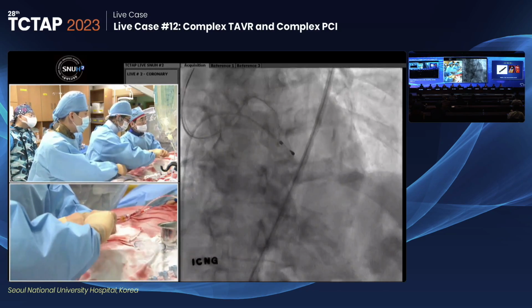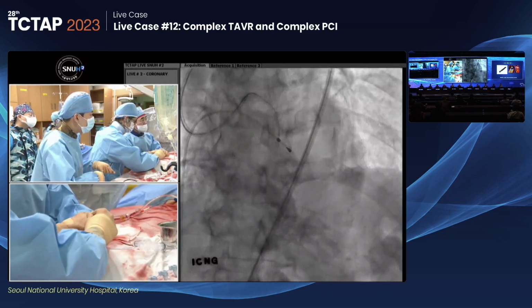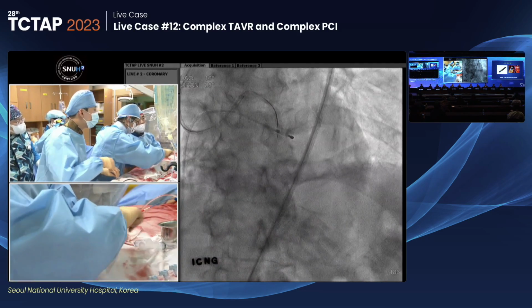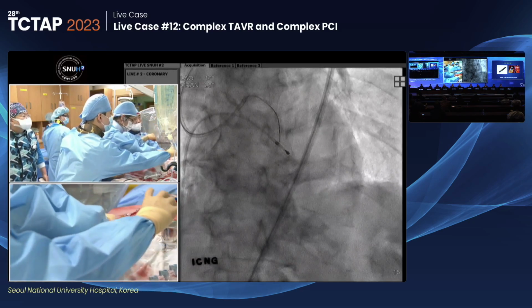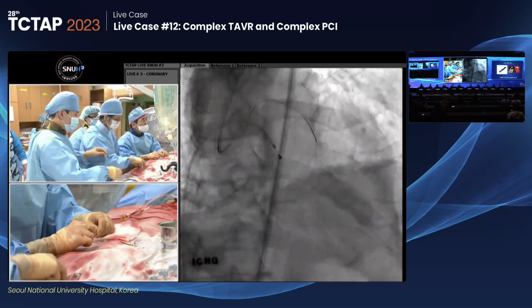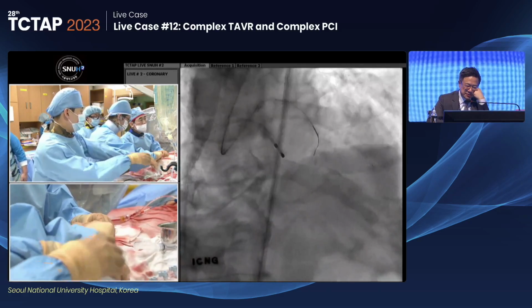Balloon angioplasty was not helpful, because I once again tried the rotor wire advancement. So you have a microcatheter in there; just try the best you can to wire it.